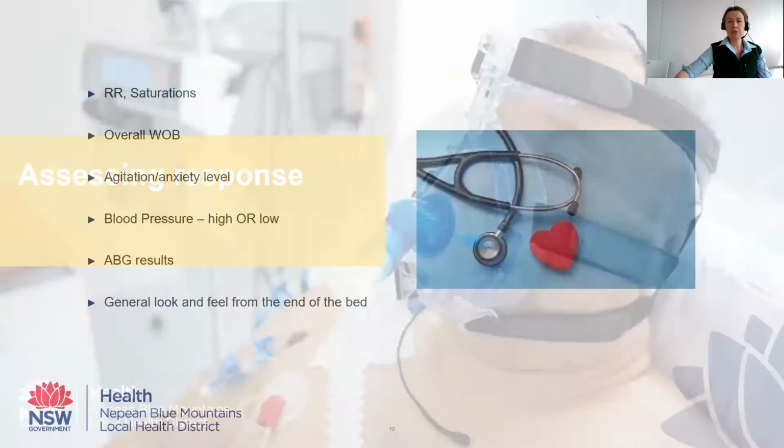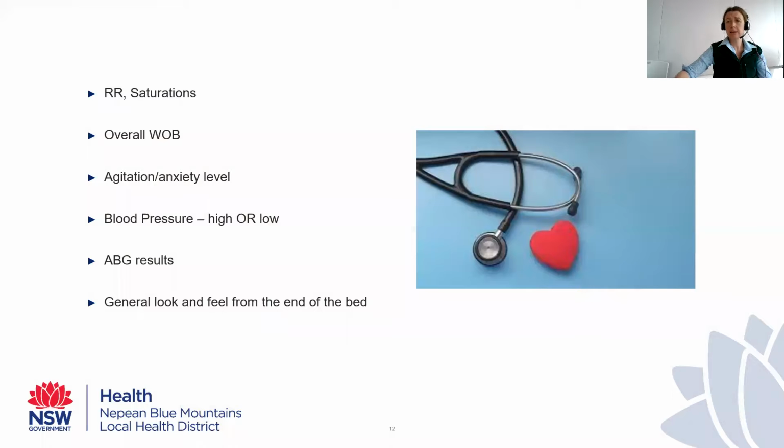So assessing response. Good respiratory assessment is imperative. In these patients that we're applying CPAP in, you want to see an effect within the first, I'm going to say, hour, 90 minutes or so. If we haven't seen an effect, and they don't need to be completely fixed, but we want to see their work of breathing decrease maybe a little bit. We want to see their oxygenation improve a little bit.